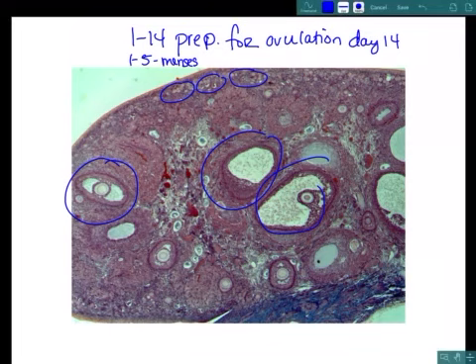If you can see these small little circles in here, these are what's called follicles. They're called primordial follicles that are holding eggs. And these eggs, a fancy word for them is oocytes, are all arrested in meiosis 1. Every month, a female will select a couple of those oocytes in those follicles. A follicle is kind of like a cocoon or a shell that provides nourishment for the developing egg. The older you are, the fewer eggs, so to say, that you have to choose from.